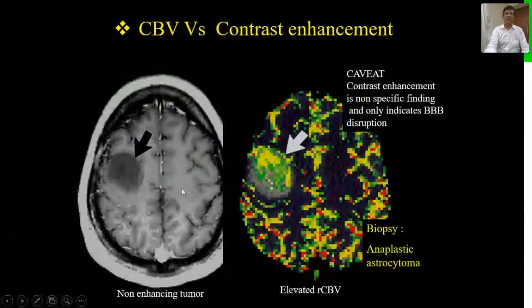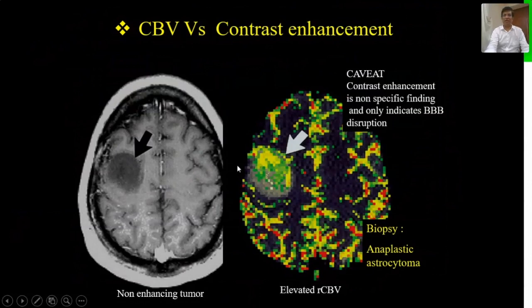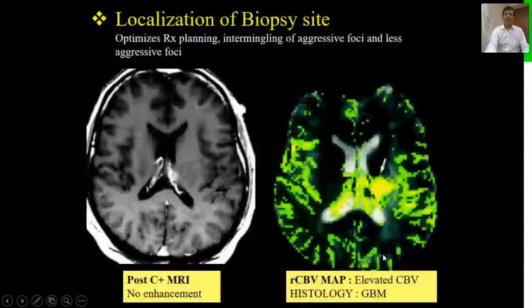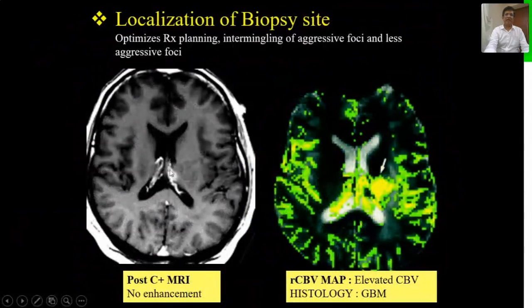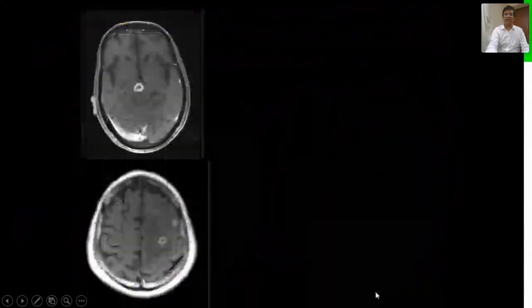Here are classic examples. On post-contrast T1-weighted images, one lesion barely enhances, but on MR perfusion its RCBV was 2.1, and on biopsy it turned out to be anaplastic astrocytoma. In another example, structural imaging shows hardly any enhancement in a left thalamic tumor, but MR perfusion showed a perfusivity of 4.1, and on biopsy it turned out to be GBM.